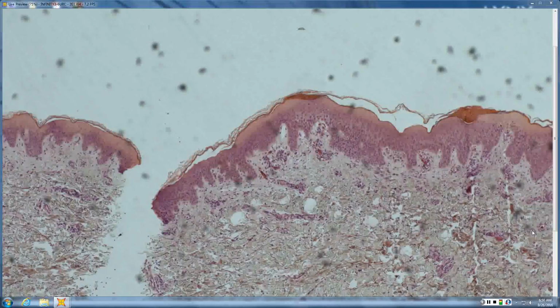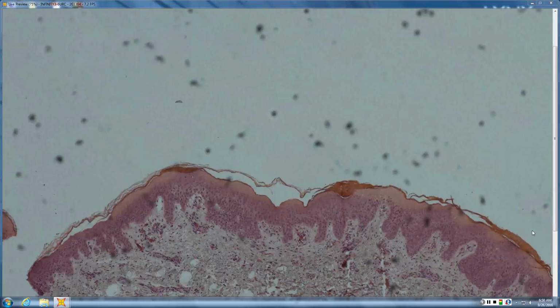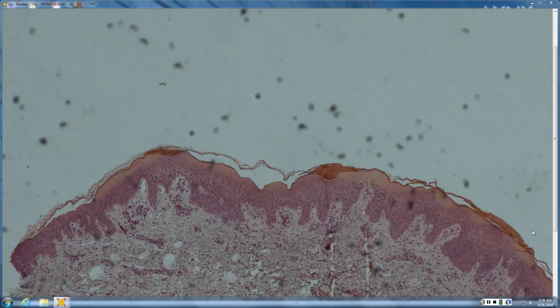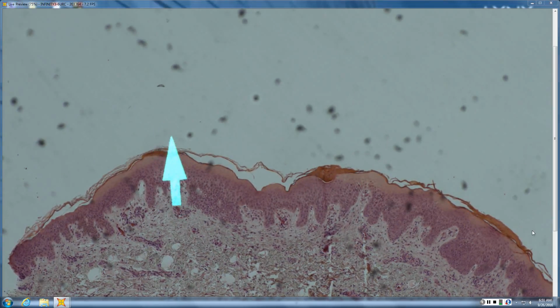Okay. So, as you guys know, pityriasis rosea is in the annular differential, and you get the expanding rings of erythema with a trailing scale. And so that corresponds very well with what you see histopathologically. You get these little foci of parakeratosis. And this is probably one small little annular ring that was biopsied. And that parakeratosis is the trailing scale. And that's what's going to correspond clinically to the scale that you actually see.